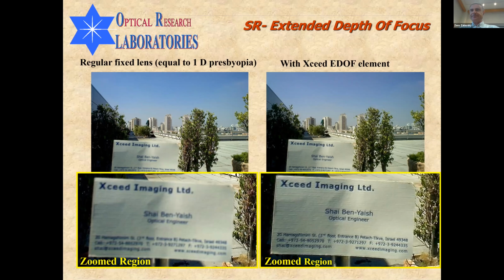And in ophthalmic applications, the sensor behind the eye is our brain. And our brain, unlike cameras, has logarithmic dynamic range. Therefore, if this reduction of contrast that increases the depth of focus is properly designed, matched to the cognitive perception of our brain, and due to the fact that the brain has logarithmic dynamic range, the user of the lenses almost does not feel this reduction of contrast. So it's not only that the image is in focus, but also the resolution and the contrast of the various spatial content of the image is undamaged.